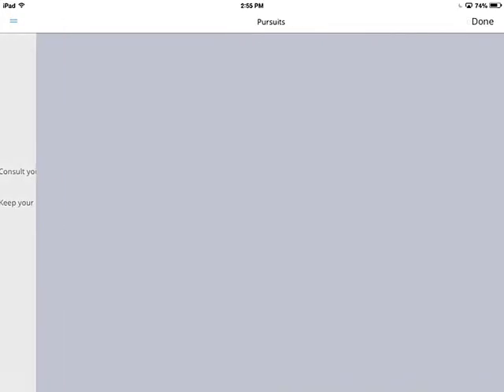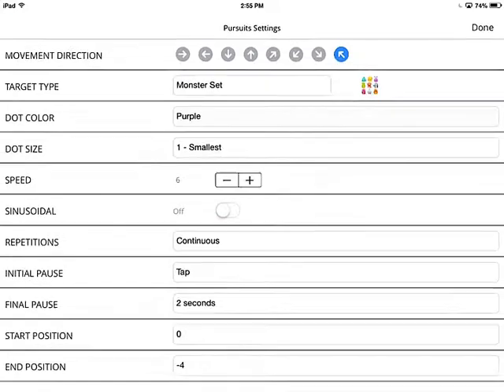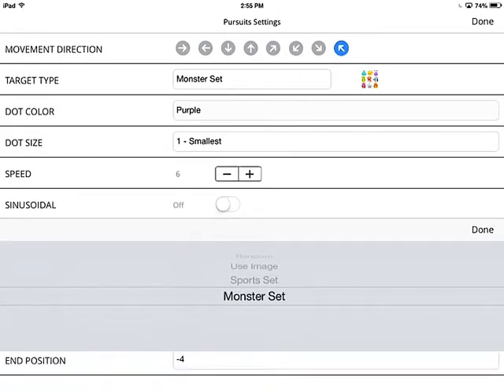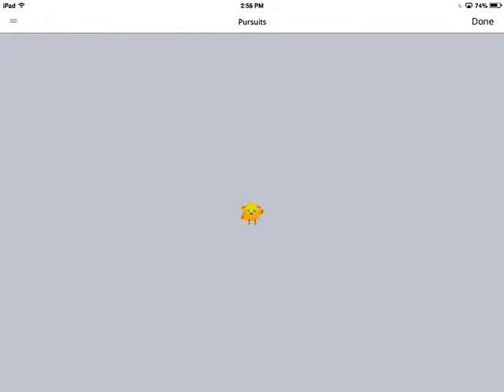Here's what that looks like — press start, it's right in the center, I tap the screen, and it moves all the way up, holds for two seconds, then comes back down. It won't start moving again until I tap the screen. For the monster set and sports set, I find that the larger sizes work better.